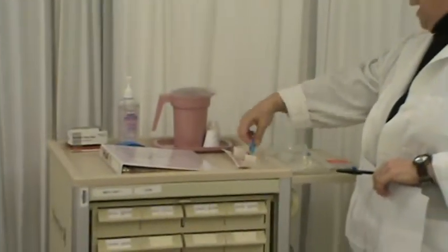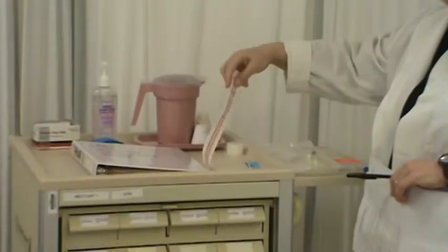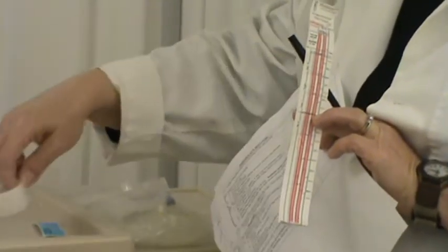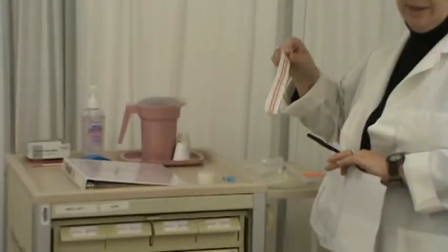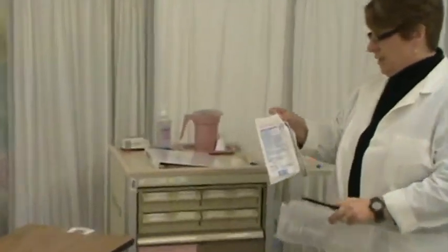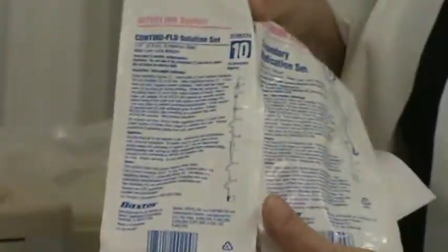You'll have to have tubing labels for the date. You'll have to either have tape or a strip so that you can label your primary bag. It's called a timing strip. You'll get the instruction on that in class. And then you'll have to be able to choose the two proper tubings that you need, the primary tubing and the secondary tubing. And we'll talk through all of that.